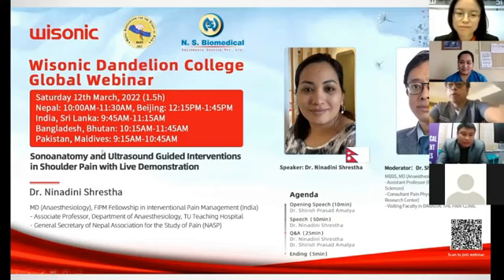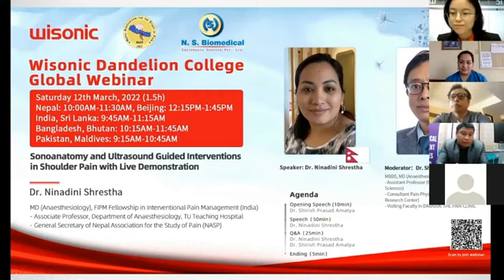In this webinar, we would like to talk about the sonoanatomy and ultrasound technology in the diagnosis of pain.